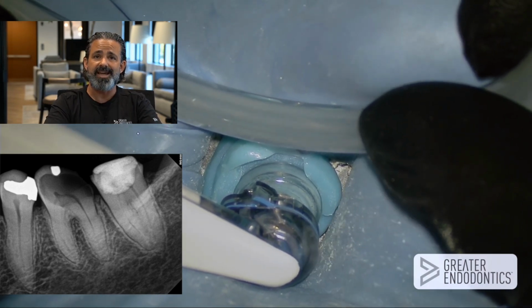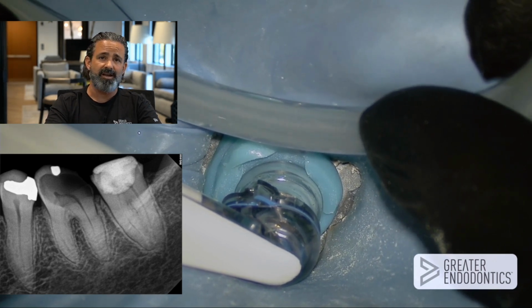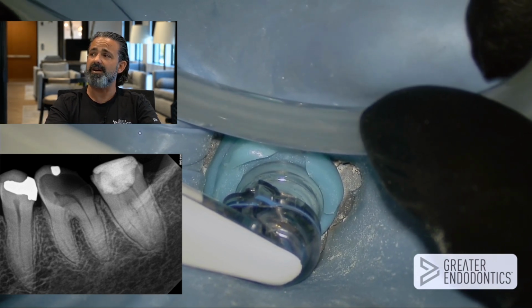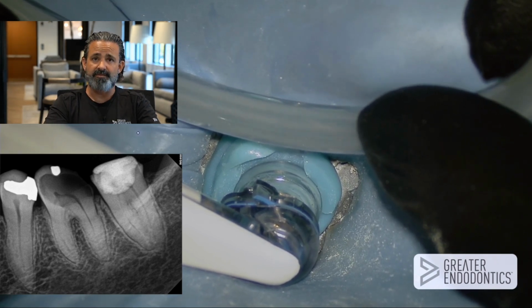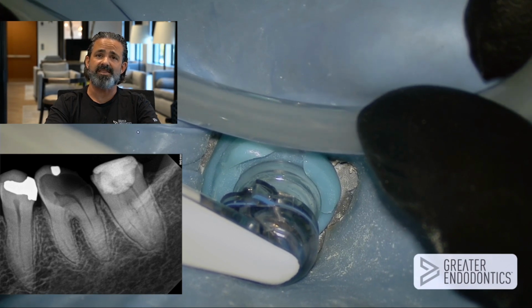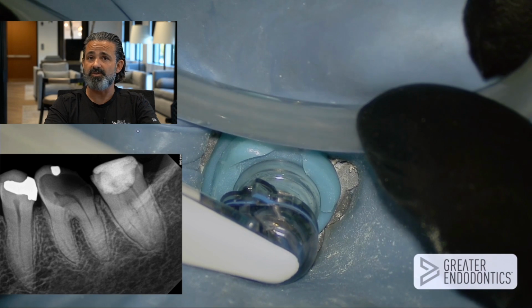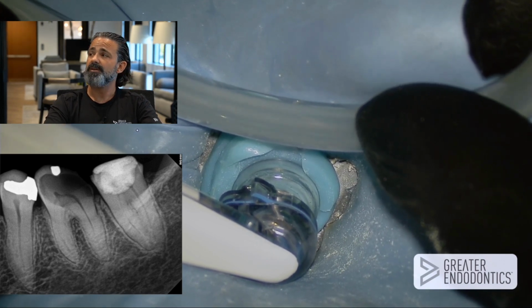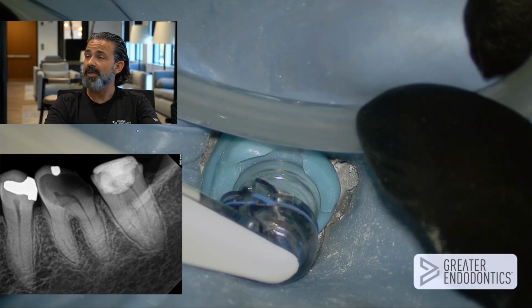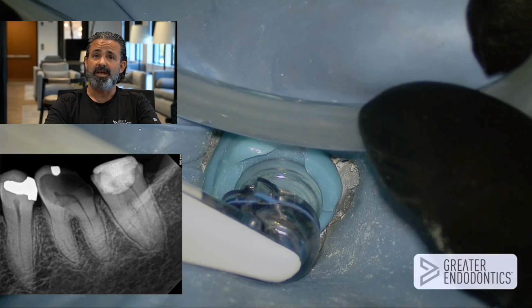It's doing it in a degassed environment. So as we hold this procedural instrument on, I want to maintain that degassed environment. If there's an air leak from my platform build, that environment changes and then the efficacy is not there. So our job now is to actually hold the PI and pay attention to those details and create that environment to employ this energy through the tooth. And I'm really conscious of it because this is a compromised tooth and I don't want to compromise care. And I had a problem with patency at the beginning.